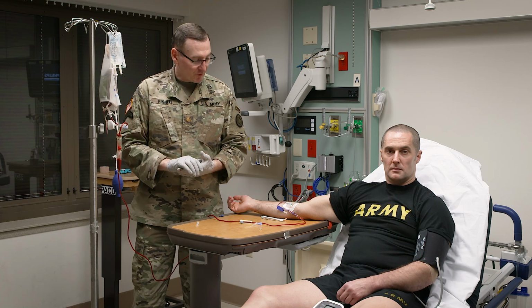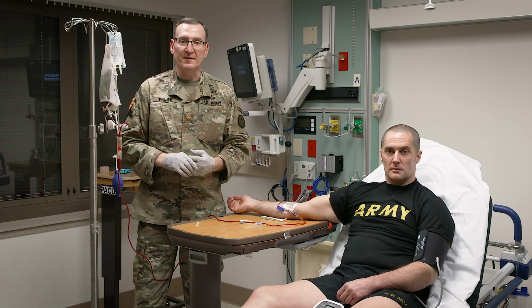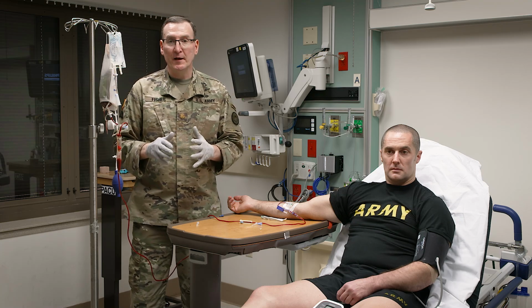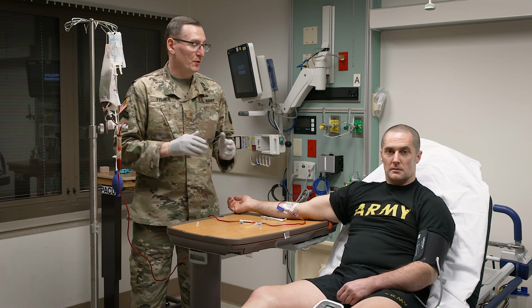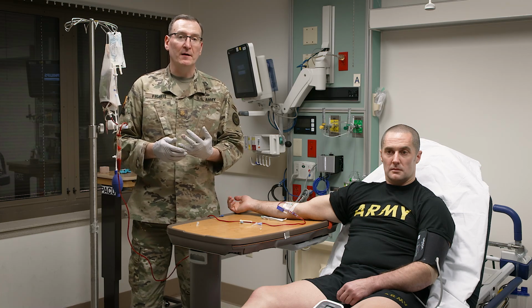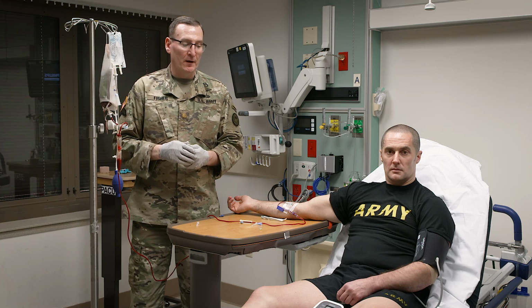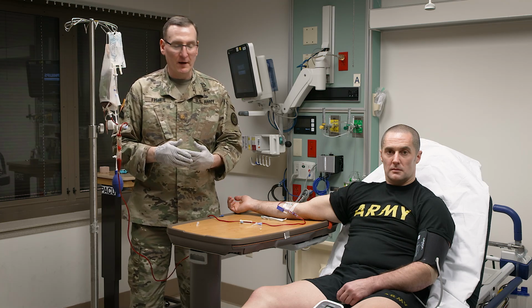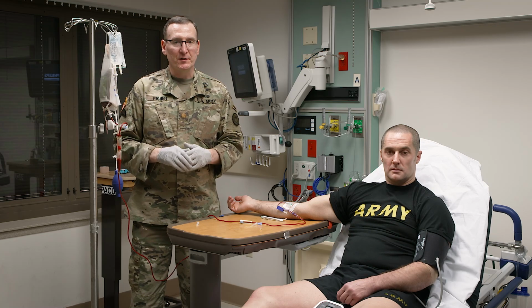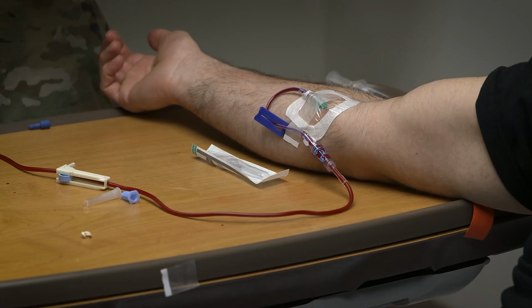And then from there, the most concerning reaction that I may see is an ABO incompatibility, which means that I gave blood of the wrong type to the patient. If that were to happen, the patient may have back pain, fevers, chills, muscle pains, and if the patient is peeing, they will have a decreased urine output. For that sort of situation, you need to stop the blood transfusion immediately and begin resuscitation with crystalloid.